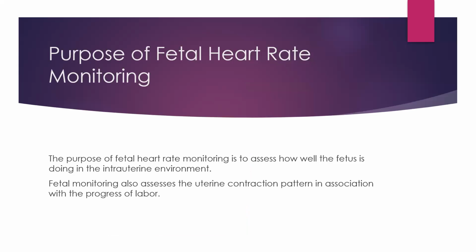So the purpose of fetal heart rate monitoring is to assess how well the fetus is doing in the intrauterine environment. So how well is this baby doing inside of the uterus? Are they thriving? Are they surviving? Are they doing well? Or are there interventions that we need to do in order to help this baby stay thriving in the intrauterine environment?